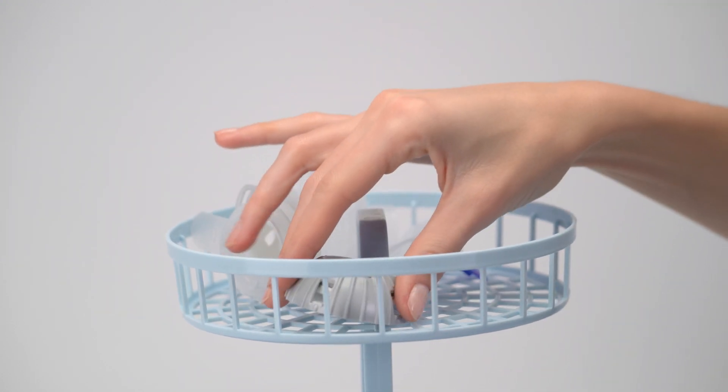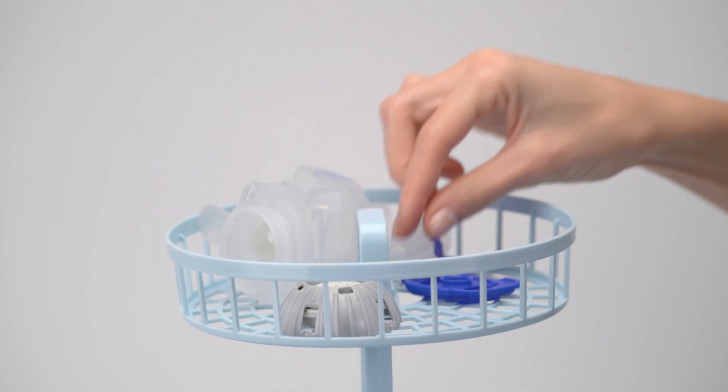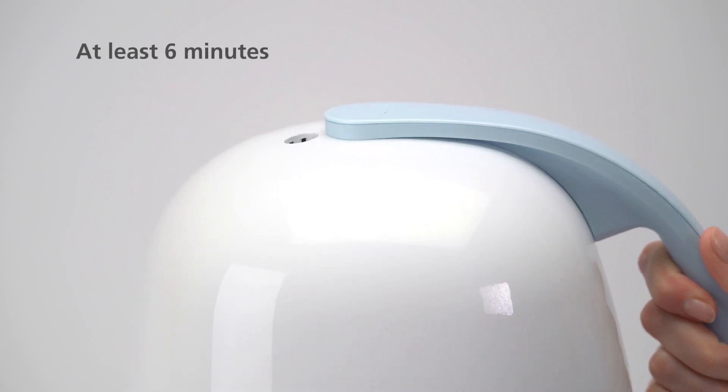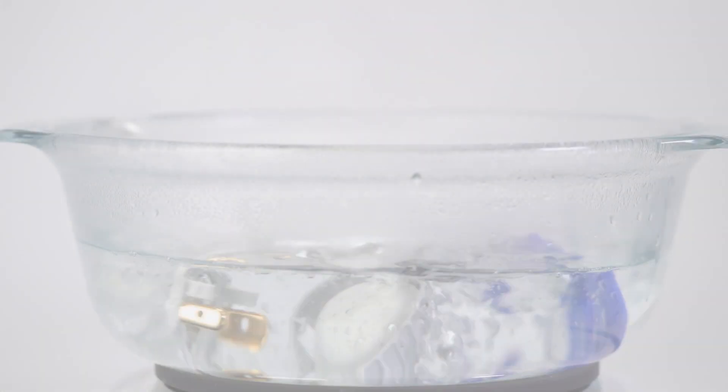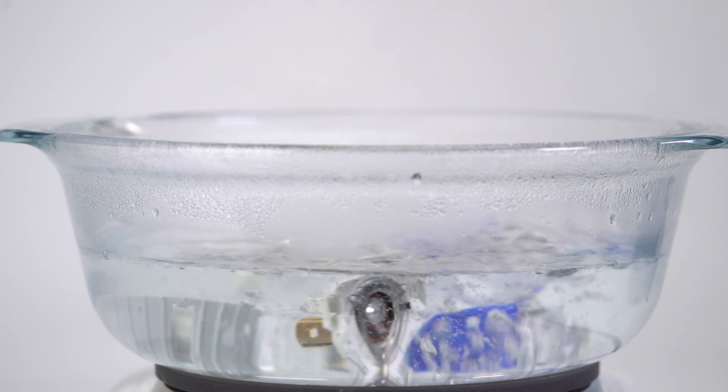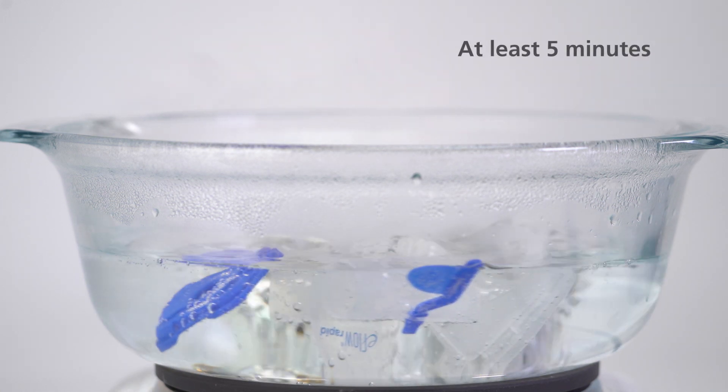To do this, use a standard baby bottle disinfector and run for at least six minutes. Alternatively, you can use a saucepan with distilled water for at least five minutes on a rolling boil.